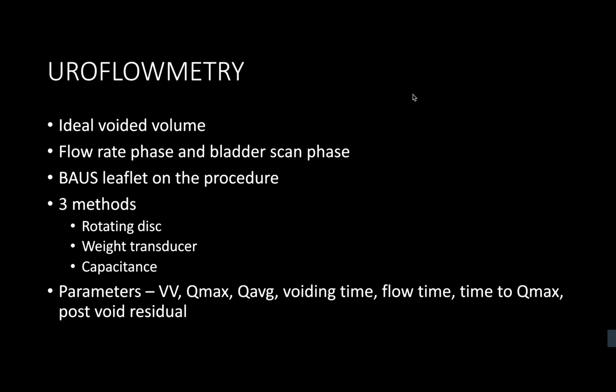How does uroflowmetry work? Sorry, can you repeat the question? Yeah, you said you will do uroflowmetry for him. How does it work? So uroflowmetry will produce a graphical printout of a patient's flow, which is measured in mils per second, against the x-axis, which is the time in seconds. It'll help determine the maximum flow rate, provided that a minimum voided volume is produced. It will also give an idea as to the length of time the patient is voiding, as well as the likely pattern.